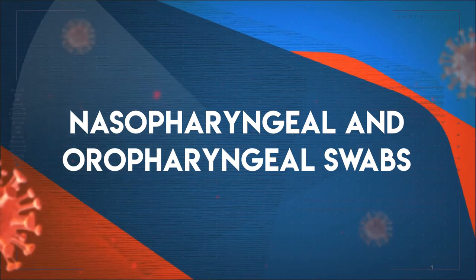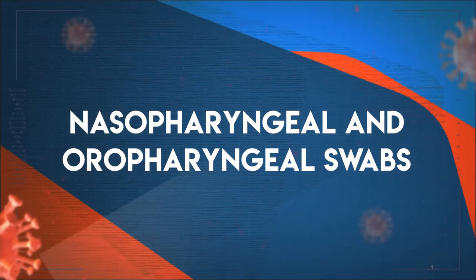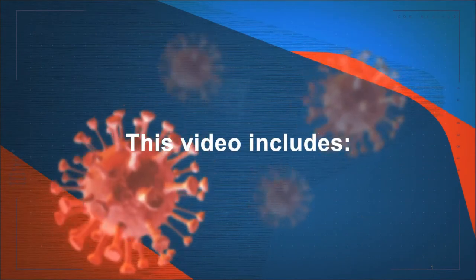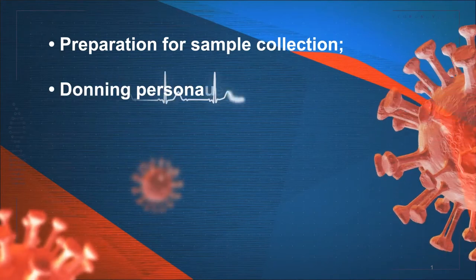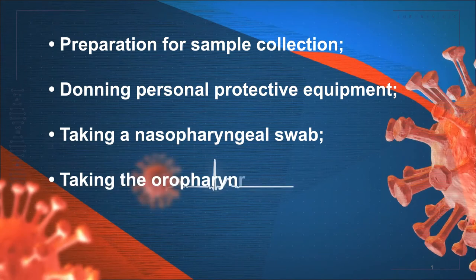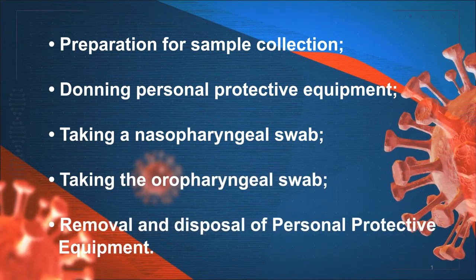Nasopharyngeal and oropharyngeal swabs. In the following video, we are going to show you the steps necessary to collect nasopharyngeal and oropharyngeal swabs. This video includes preparation for sample collection, donning personal protective equipment, taking a nasopharyngeal swab, taking the oropharyngeal swab, and removal and disposal of personal protective equipment.